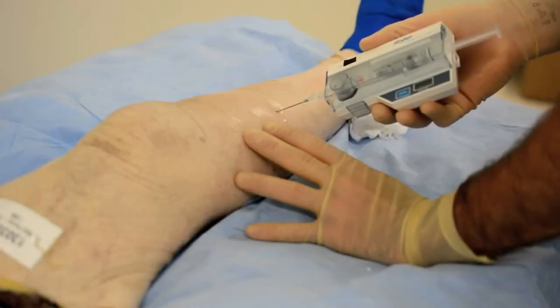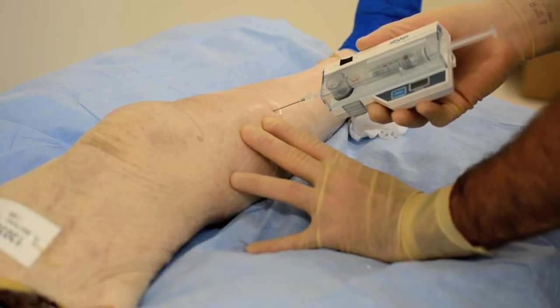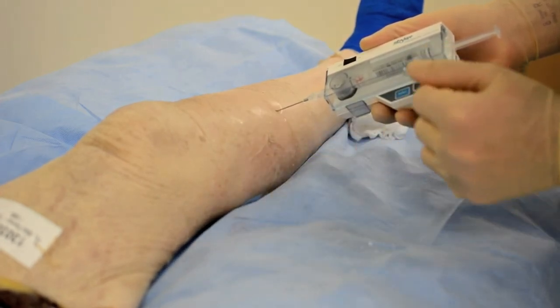It's important to allow stabilization of the fluid column to get an appropriate reading. You then can verify you are transducing from the compartment by gently palpating on the compartment and seeing the appropriate pressure bump.